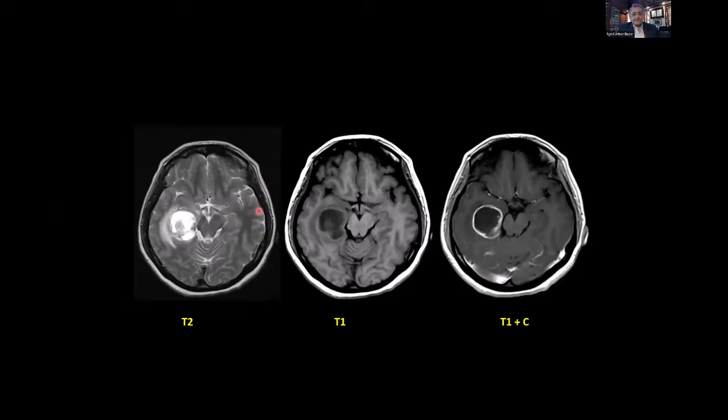And an abnormality like this, for example an abscess over here with liquid and necrotic material inside, shows up. Actually, I don't remember if this was an abscess or not. This is one of my patients, probably, and it turned out to be a GBM, if I'm not wrong. So it shows this necrotic material, which is hypointense, and this is hyperintense on T2. The CSF will always be hypointense on T1, and it will be hyperintense on T2. The fat will be hyperintense on both.